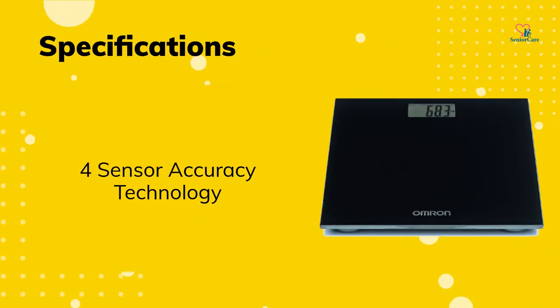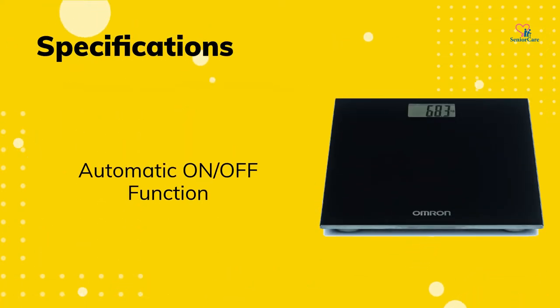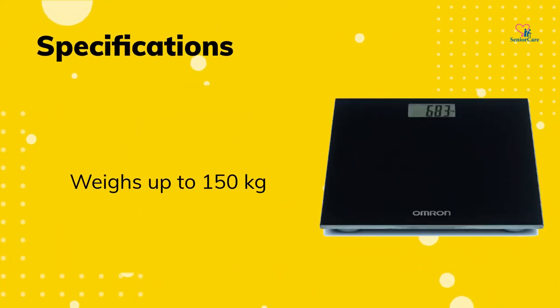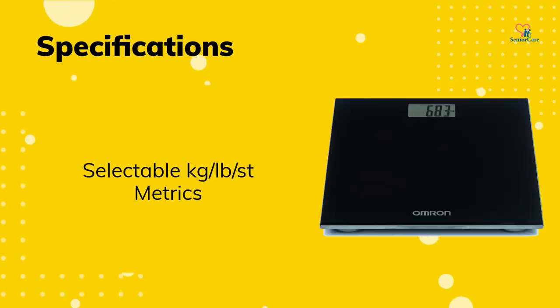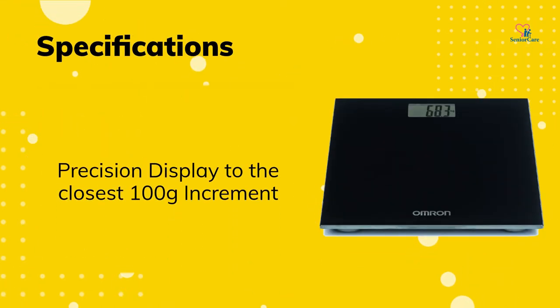It has 4-sensor accuracy technology and an automatic on and off function. It can carry weights up to 150 kg, with selectable kg, LB, and stone metrics. Precision display to the closest 100 g increment.